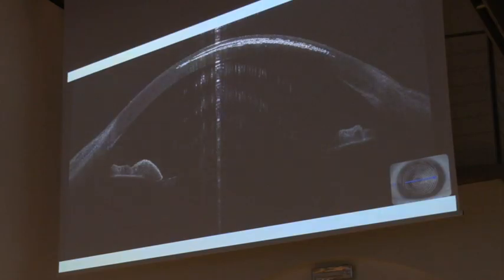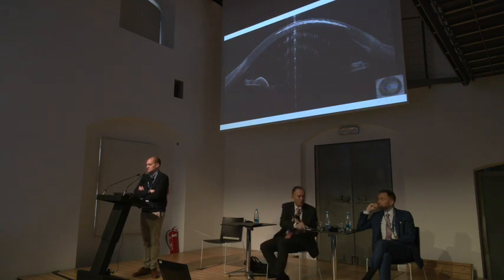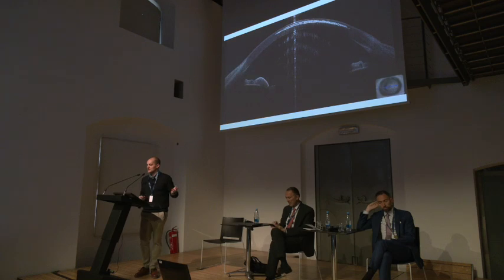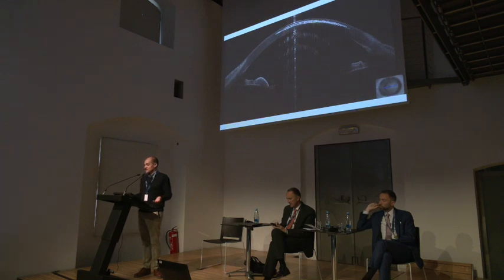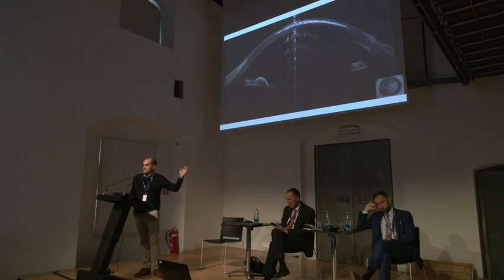Now, let's look at something a little bit more interesting. This is something that Scheimpflug could never image. This is a partially created lenticule. The patient moved during the cut, the vacuum didn't release, and this is maybe 3 minutes, how long it took for me to get from the OR to the MS-39. And a decision was made at that point, hey, this is not extractable, but let's see how it looks. You could never image this with Scheimpflug because you would just get a big reflection.